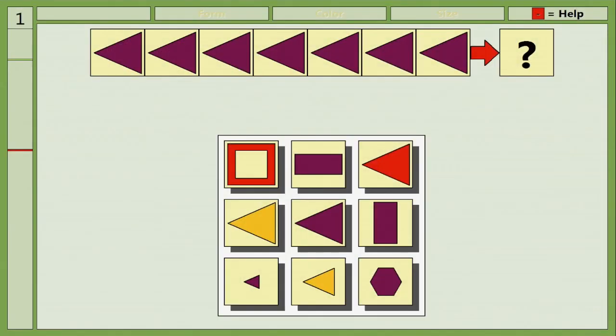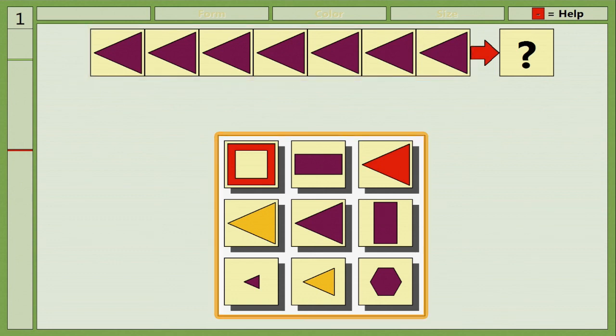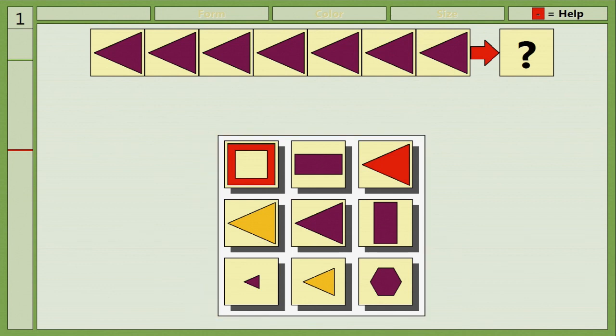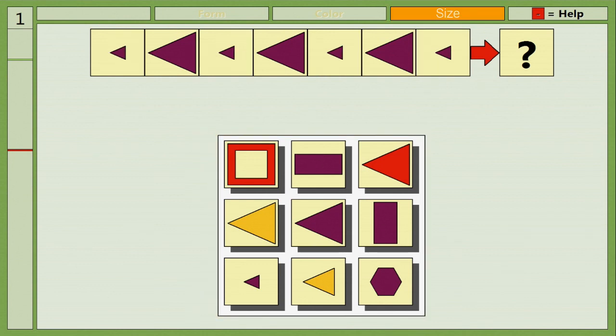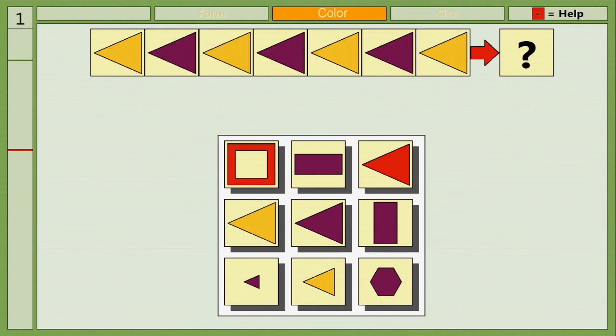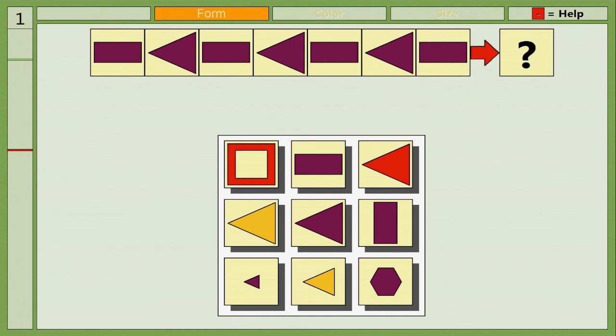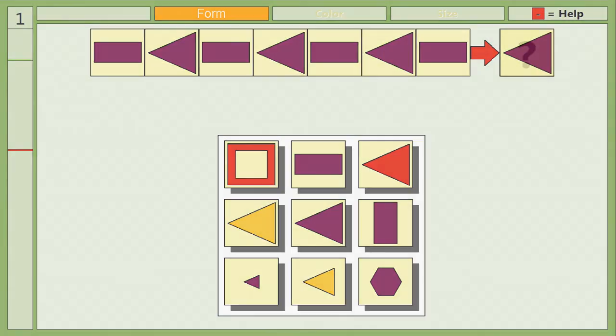The task in this module is to complete a sequence of shapes on screen. The patient is presented with a row of shapes and a selection of additional shapes underneath. Based on their analysis of the size, color and order of the shapes in the row, they complete the sequence with one of the items from beneath them.